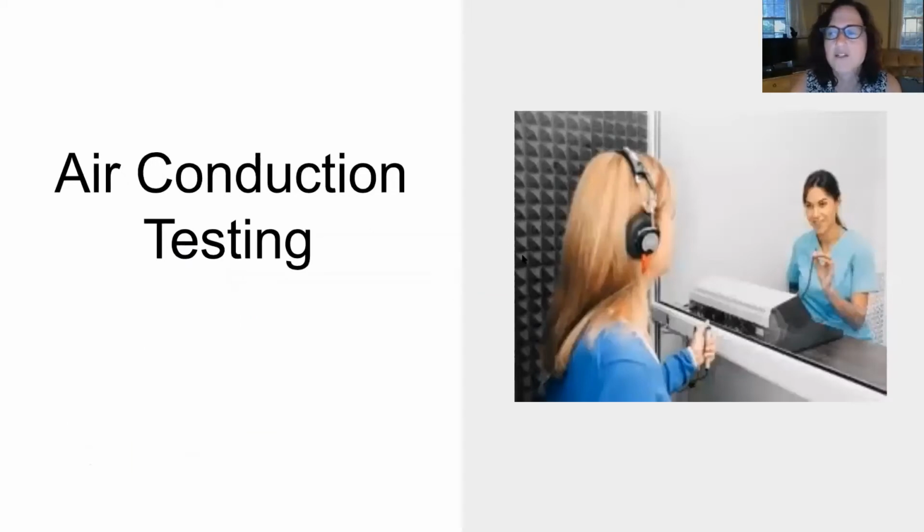Okay, so air conduction. This is an example of somebody having an air conduction test. She's sitting here with headphones on because that's where the sound is going into her ear. The audiologist is going to provide her with those pure tone frequencies, and as she hears them and they go quieter and quieter, she's going to click, and mark down at each frequency the quietest sound she can respond to.